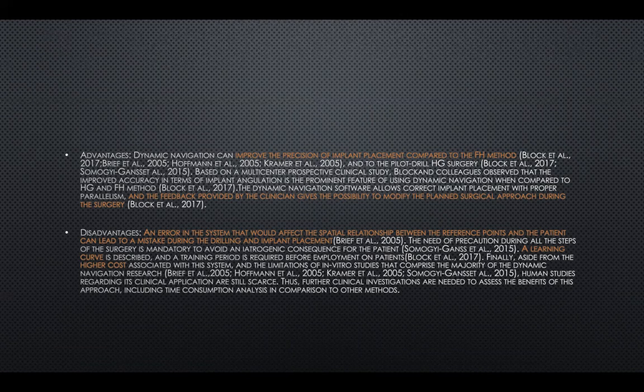The disadvantage is that it's technique sensitive. Once you get familiar with all the components and parts, it gets easier, but if we have an error in one of the steps, it will reflect on the following steps, and the whole situation becomes compromised.